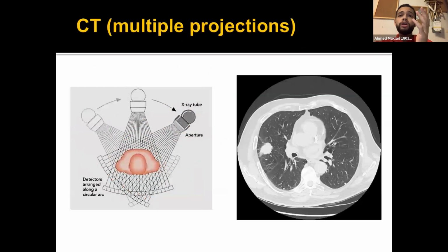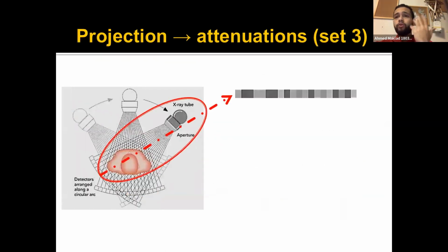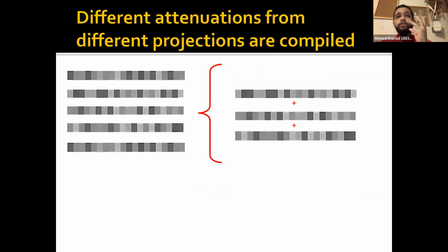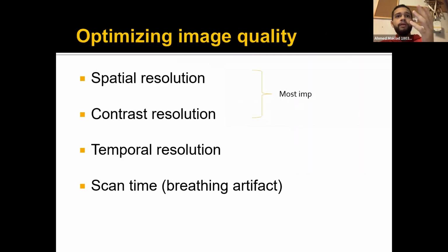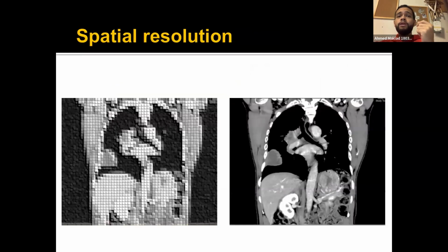So what do I want you to focus on? Honestly, the only thing I want you to focus on is that you have one X-ray tube, and you have multiple detectors. And that's the difference between a CT and an X-ray. You have multiple detectors, right? And you need to know that the software is used to give you a CT image. It's not something natural like an X-ray. That's basically what I need you to focus on from all those slides, right?